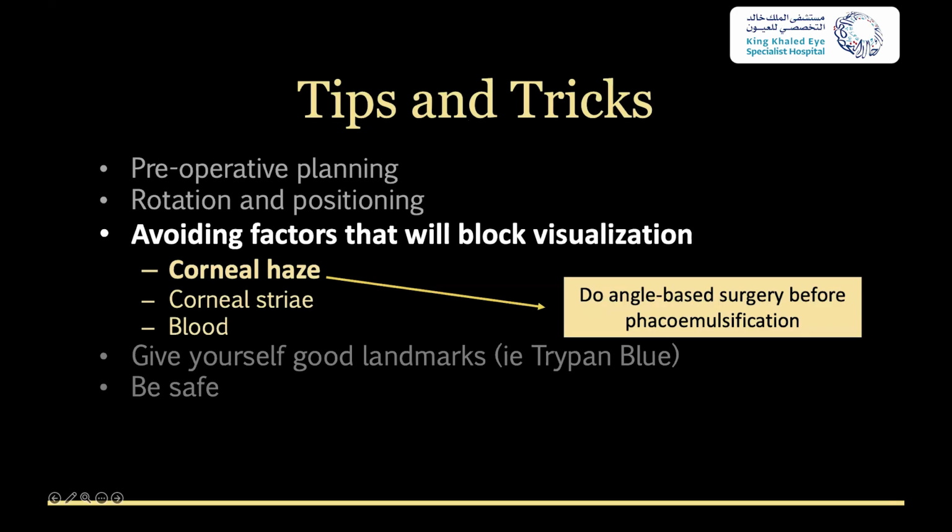So in my opinion, I like to do the angle base first. I get a clearer cornea at the start of the case. Even if it's a quick phaco case, sometimes you end up getting a little bit of corneal edema that makes angle-based surgery a little bit trickier.